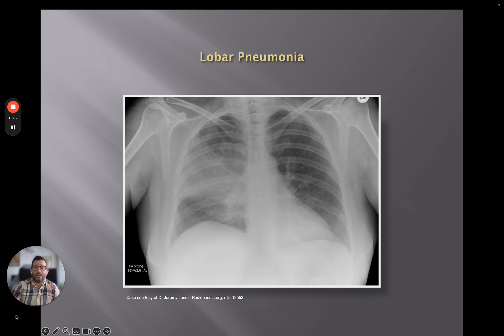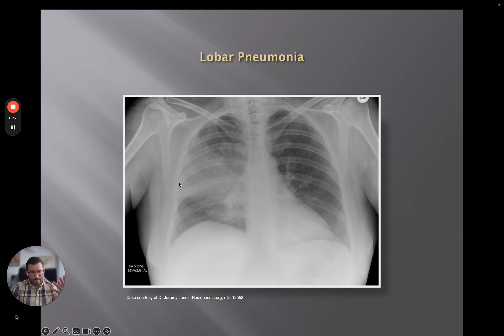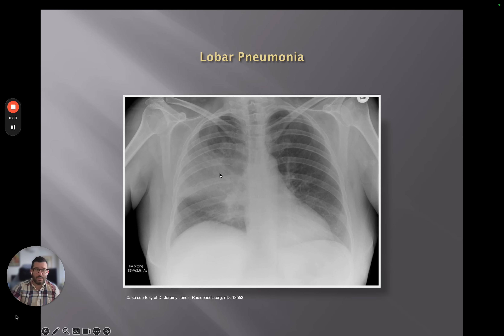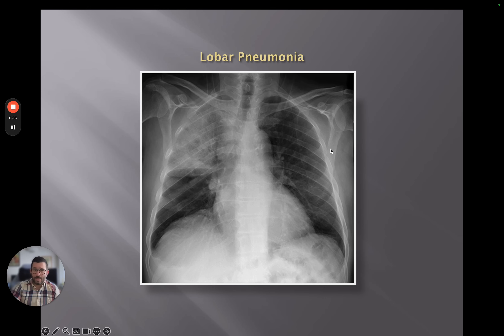Infection can look like many different things, but what we instantly think of is these big areas of lobar pneumonia. We've got dense consolidation — the air spaces are filled up with material, which could be fluid, pus, or in other contexts, blood. Here we can see a lobar pneumonia in the right upper lobe because it sits superior to the minor fissure, so we know that's in the upper lobe.